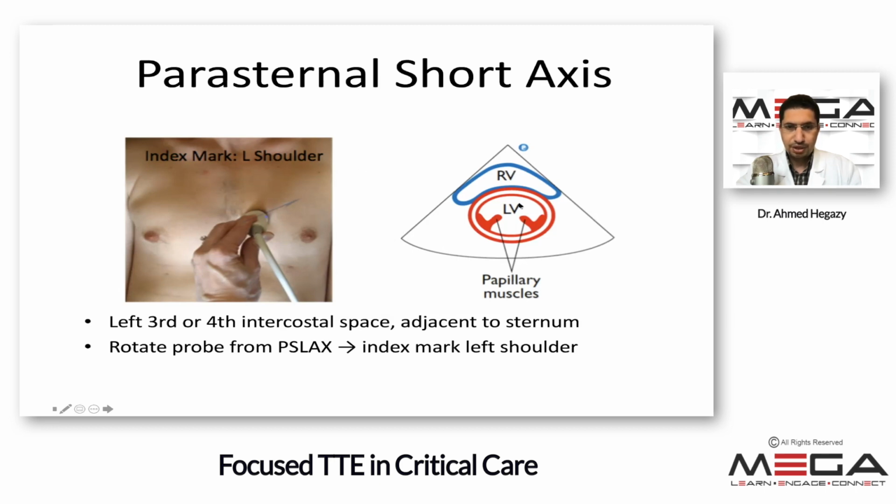And here you will cut the left ventricle in short axis. The left ventricle here will look like a donut, and you will see the right ventricle usually between 9 o'clock and 12 o'clock.